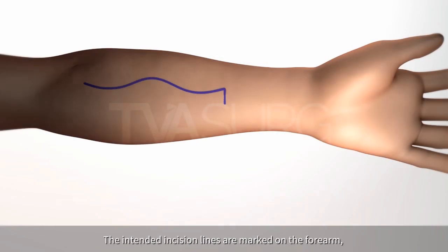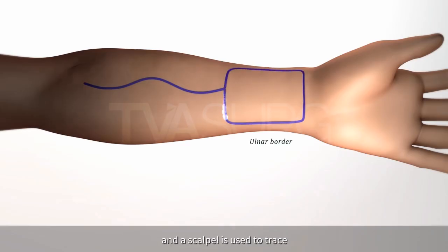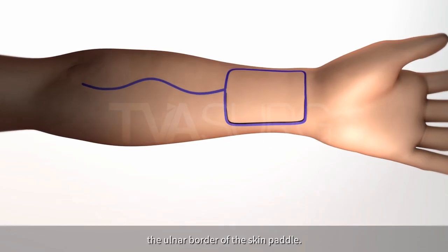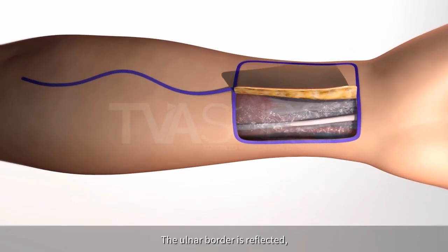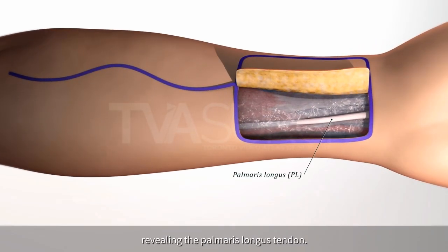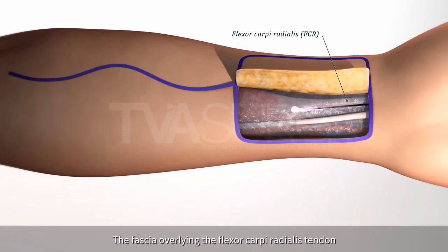The intended incision lines are marked on the forearm, and a scalpel is used to trace the ulnar border of the skin paddle. The ulnar border is reflected, revealing the palmaris longus tendon. The fascia overlying the flexor carpi radialis tendon is divided.